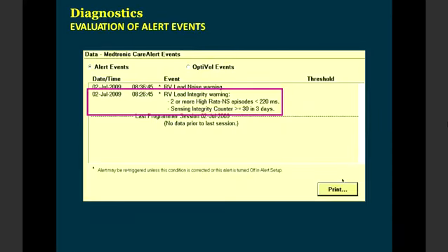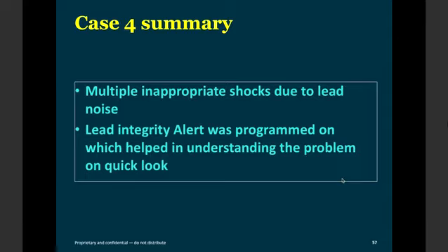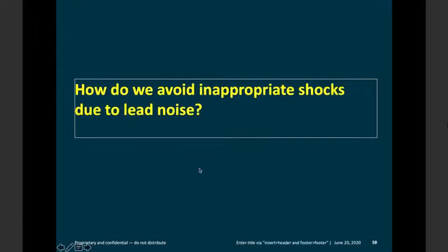So that is why this patient had this lead integrity warning in the first place. To summarize this particular case: multiple inappropriate shocks due to lead noise. The lead integrity alert was programmed on, which helped in understanding the problem on quick look itself.